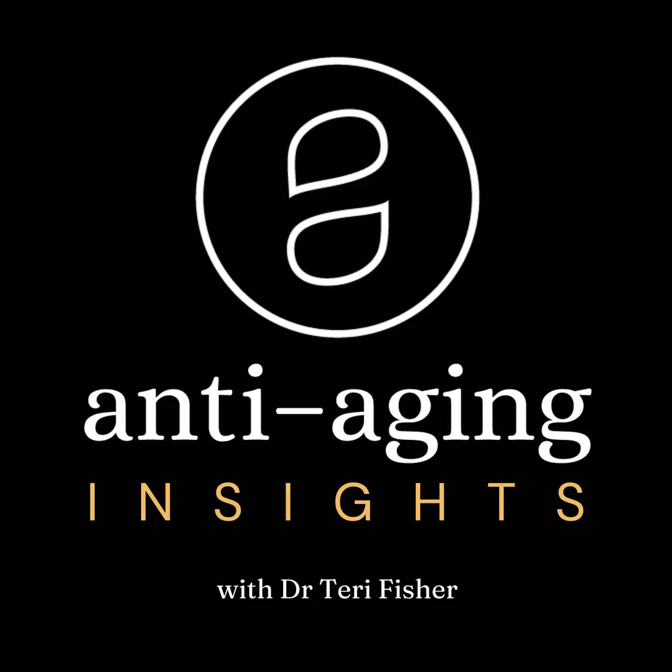The other thing is that they're not ideal for large volume treatments because if you want to have some type of substance deposited in a large area, you would have to use multiple needle pokes to do that, which becomes a little bit impractical and can become a little bit more uncomfortable as well. So the ideal situation for using needles is when we want to do Botox injections.